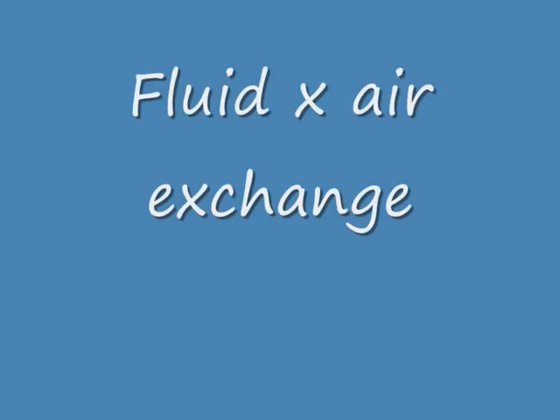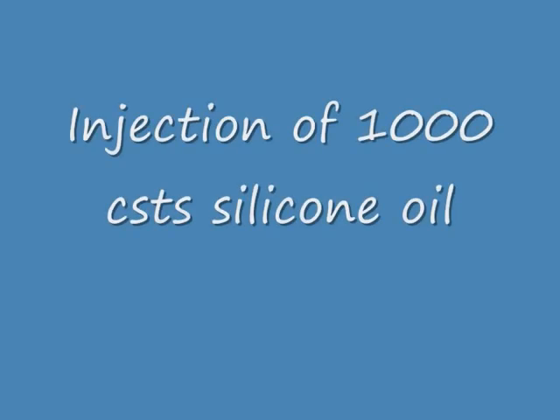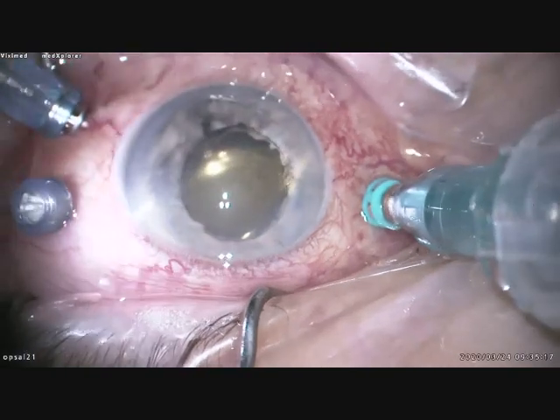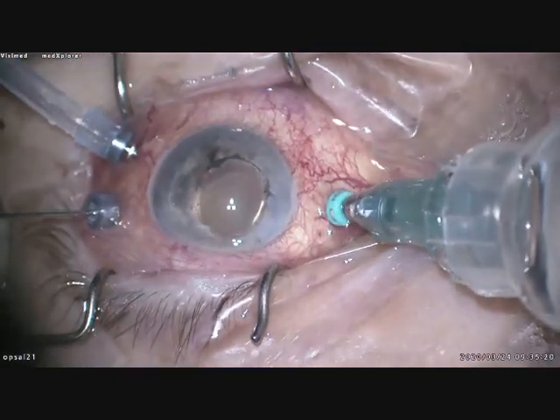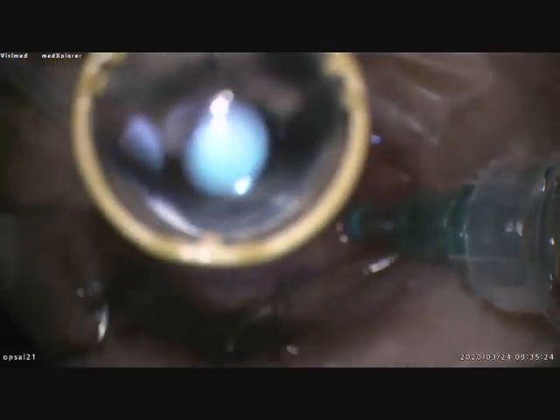So I give up and decide to re-inject silicone oil into this eye. This is a fluid-air exchange, followed by injection of 1000 centistoke silicone oil. My setup is usually 27 gauge with a 25 gauge trocar cannula.